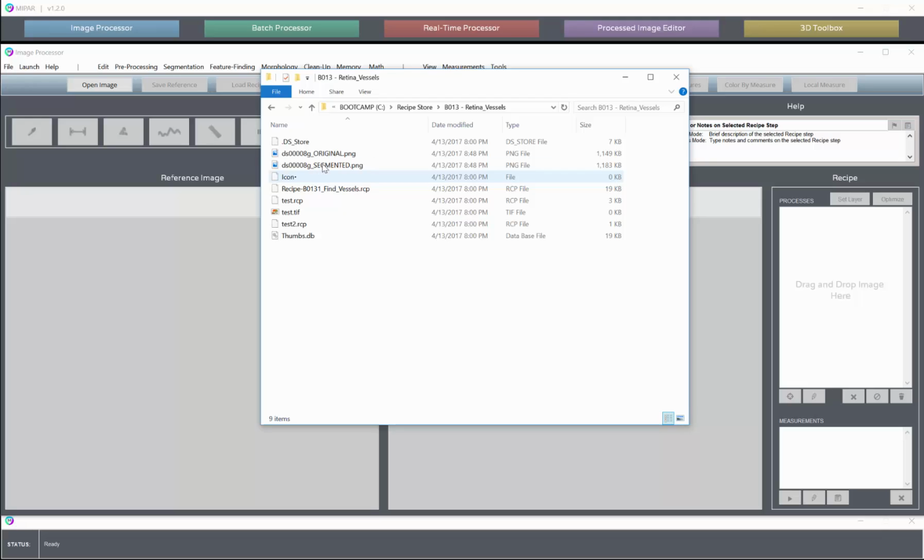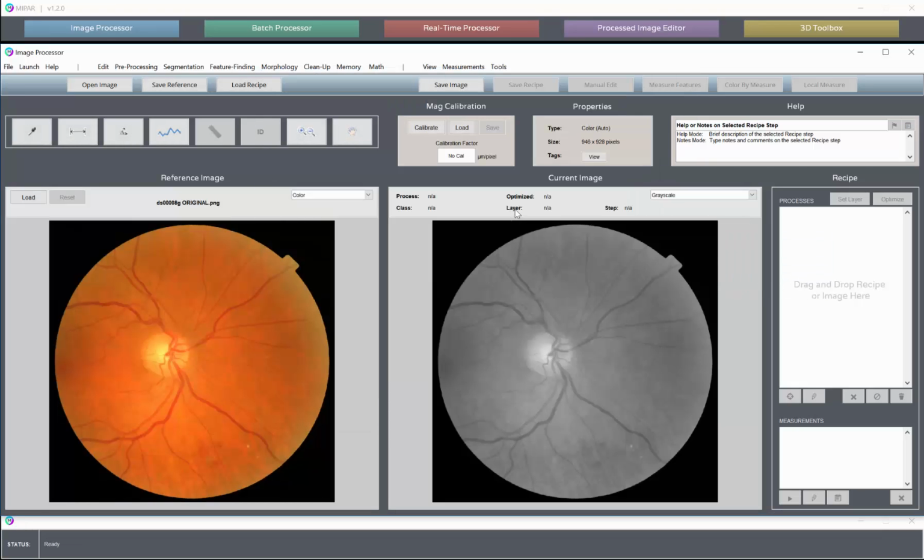We can end up needing to use a few different segmentation steps to capture both the area of interest and the features separately, and then combine both to just keep the features inside of the area of interest. So here is an example of that, where, for instance, you might go after these vessels, and I won't spend too much time on that because this is just a demo to illustrate keeping features inside of an AOI.